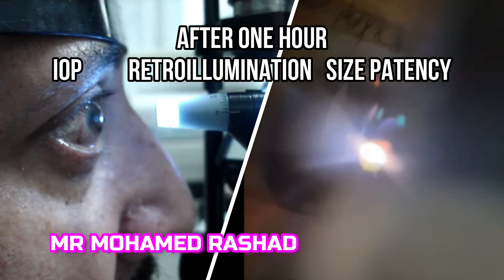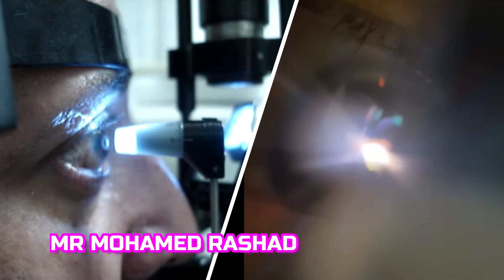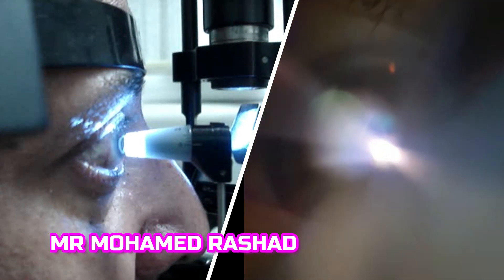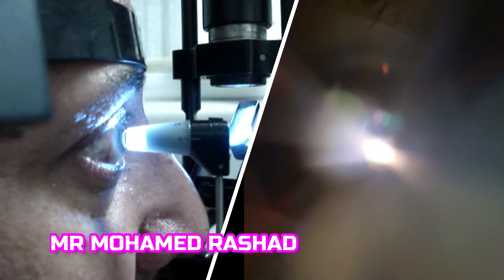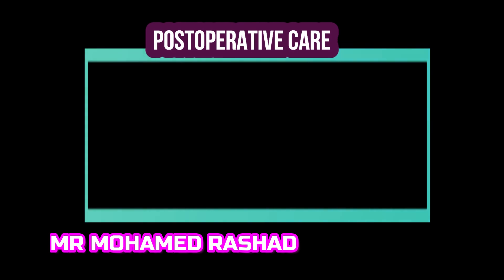After one hour you have to check the intraocular pressure and check the patency by retro-illumination, as shown by the white arrow. You place the illumination coaxially on the pupil and you can see light through the iridotomy.